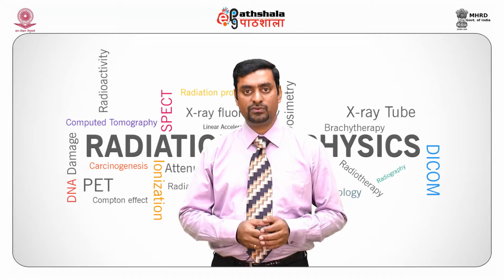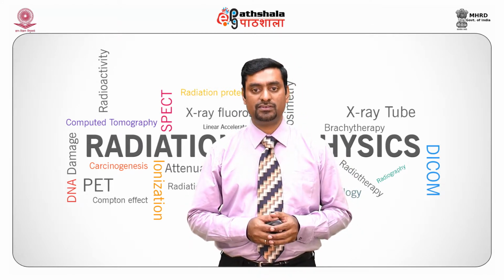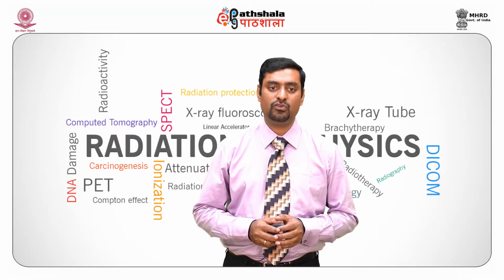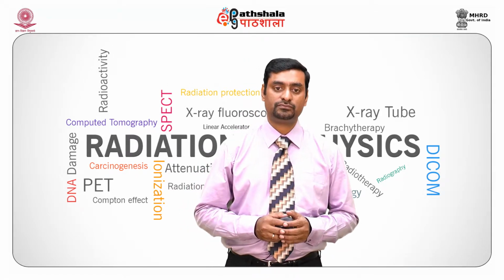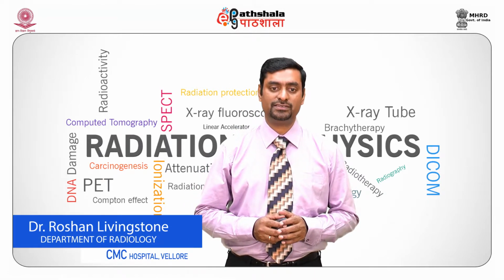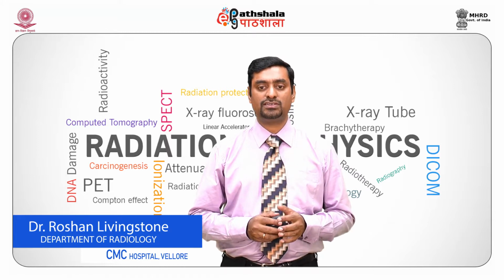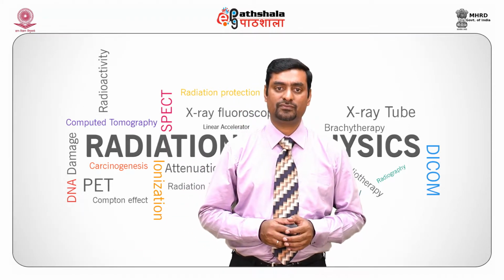In the current scenario, what we see in mammography machines for indirect flat panel detectors, a single field of view of 19 by 23 centimeters is used. It has about 100 microns detector element size, produces good contrast resolution and reasonable spatial resolution.